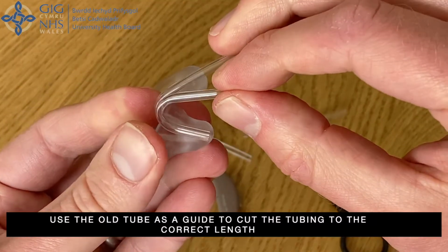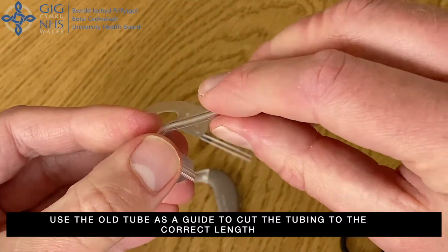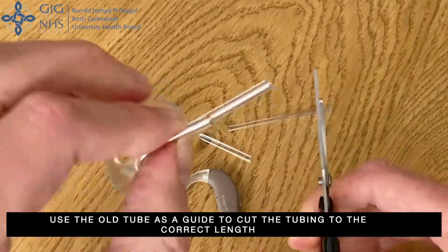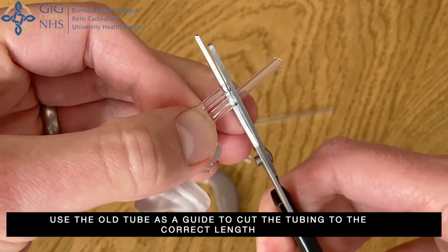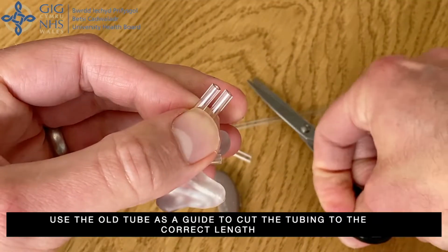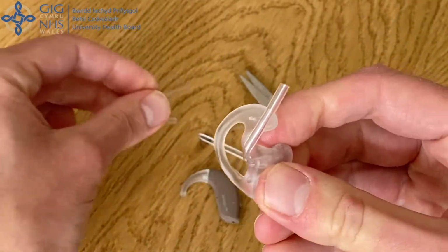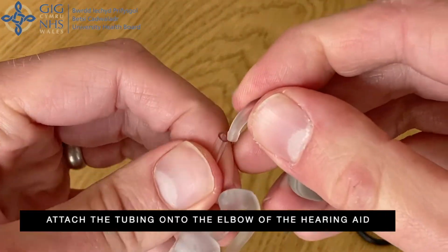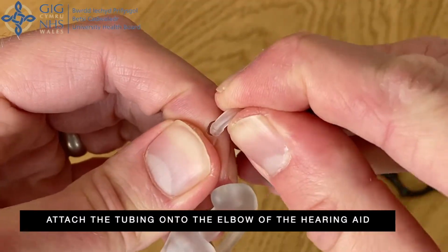Using the old piece of tubing as a guide, trim the tubing to the correct length. Attach the tubing back onto the elbow of the hearing aid.